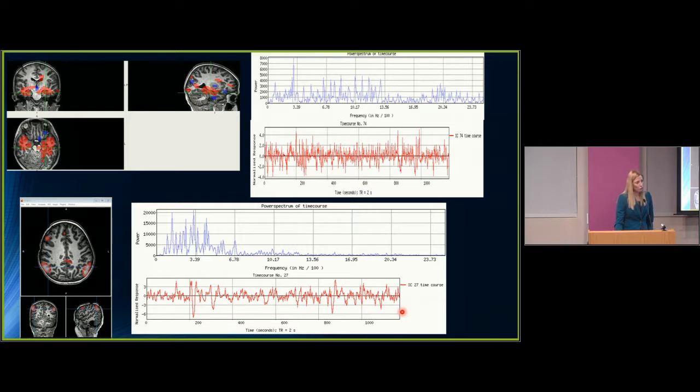But it's not unusual for a resting state functional MRI to show differences consistent with seizure when the EEG doesn't show it. Because the EEG tests the last few millimeters of brain for epileptiform activity, whereas the resting state has no such spatial limitation. So we gave him phenobarb, high doses, for about 3 days, and then after that he woke up.